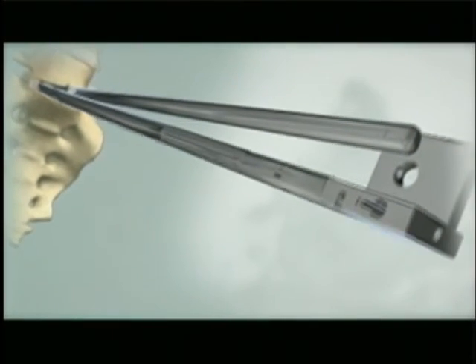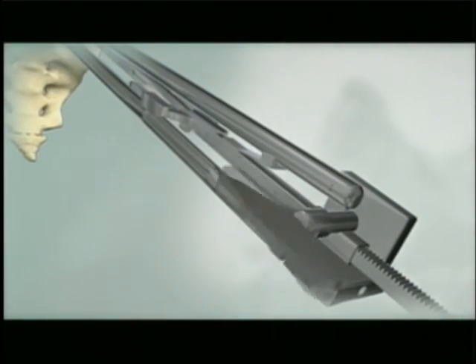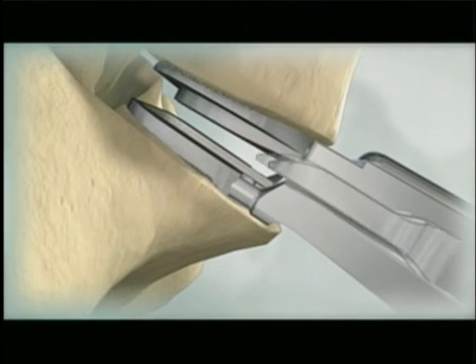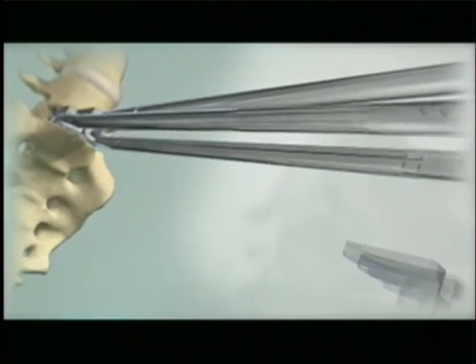Load the polyethylene inlay into the grooves in the inferior arms of the inserter. Assemble the distractor to the inserter. Use the thumb screw to fully advance the distractor. Verify that the posterior edges of the end plates have separated from each other.